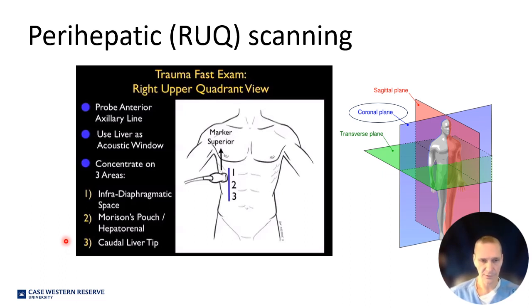However, I have learned, just report your findings. If you don't see blood, say as such. I would use caution calling any exam negative.